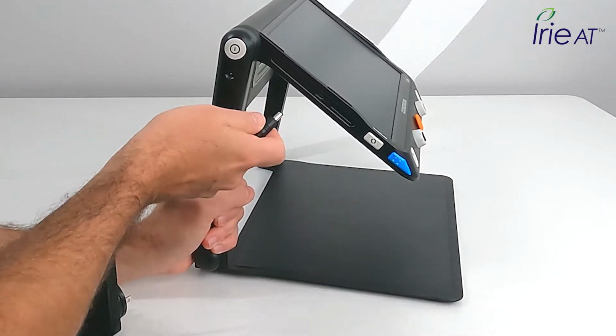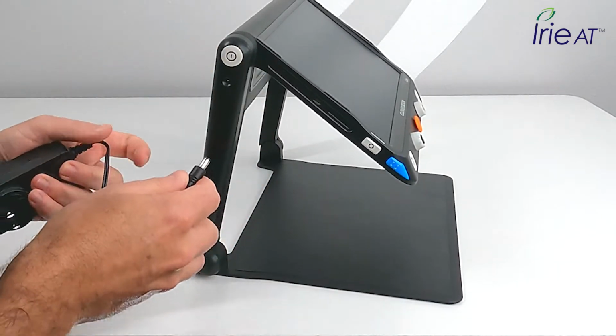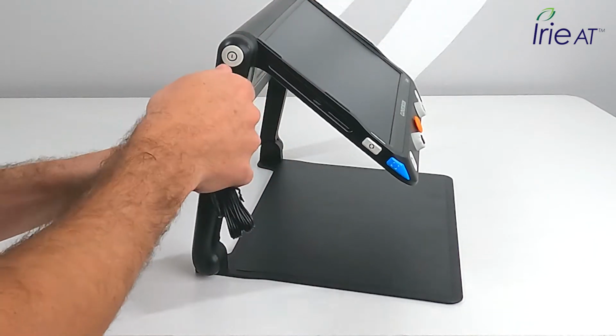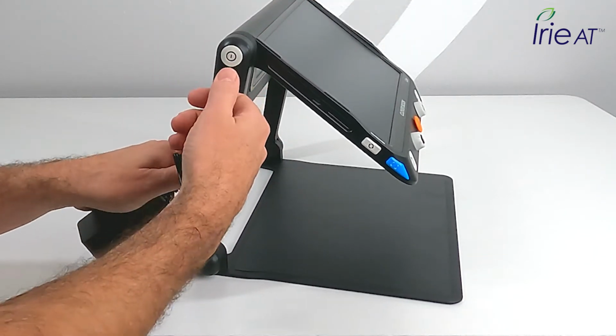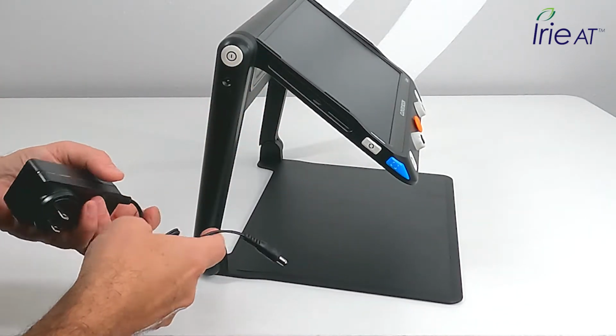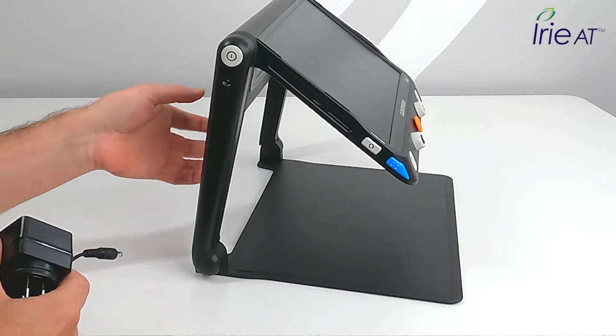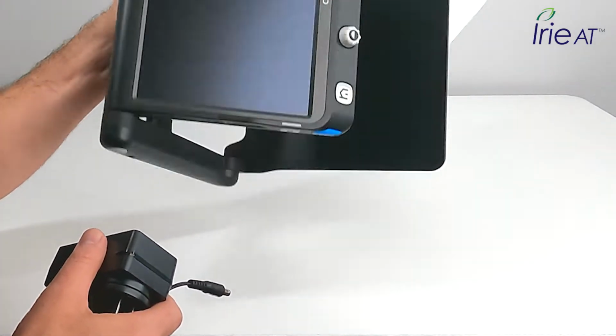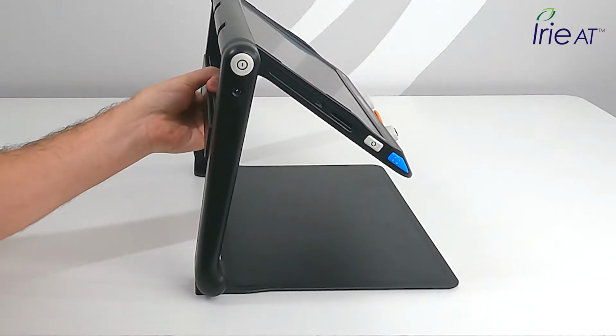Often they connect into a main board and it can be a significant repair. This one, you're not going to wreck that. It's really good. We've even seen some that came in with this completely bent and broken in the unit. We could pull it out, the unit still worked fine. Just needed a new power cord. So really cool. A lot of neat design elements to this device, just besides being really light and portable and easy to use.